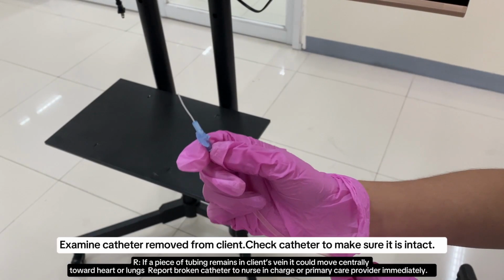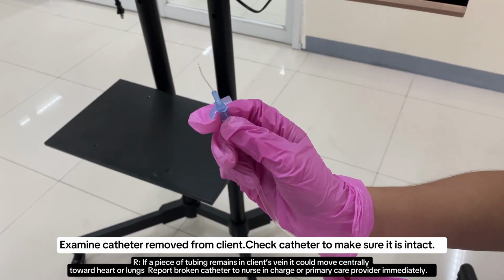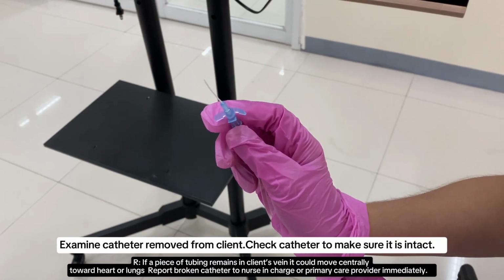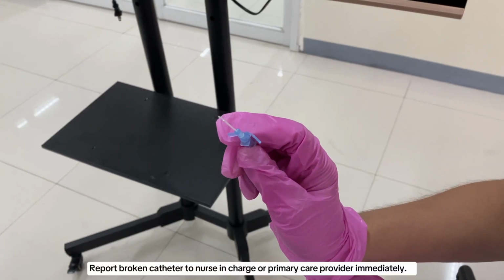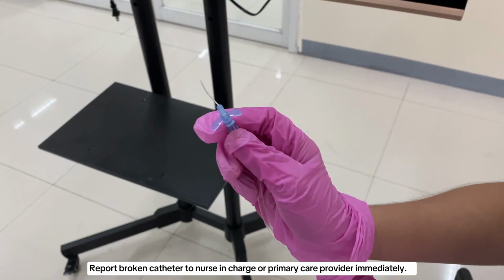Examine the catheter removed from the client. Check the catheter to make sure it is intact. If a piece of tubing remains in the client's vein, it could move centrally toward the heart or lungs. Report the broken catheter to the nurse in charge or primary care provider immediately.